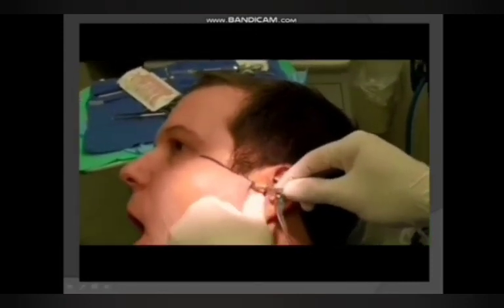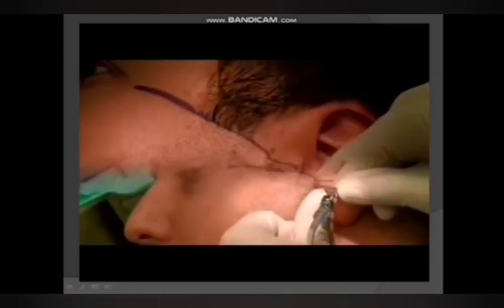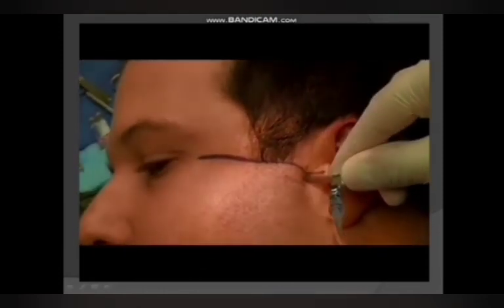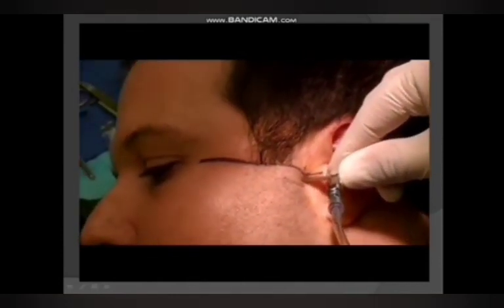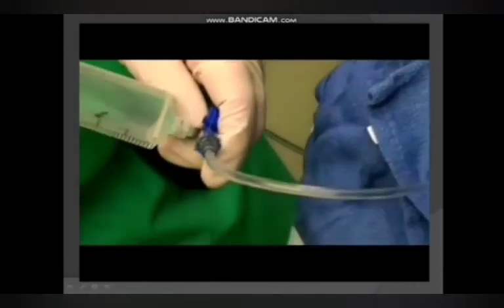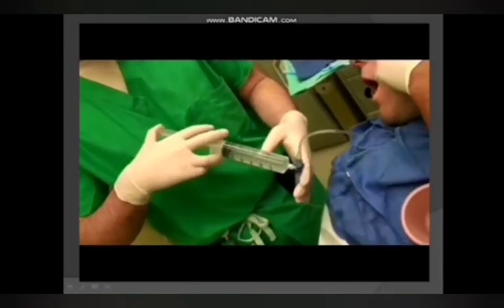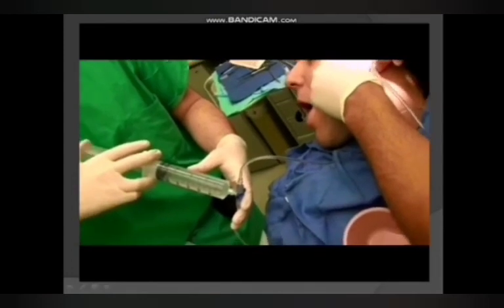The patient's jaw should be in an open and protruded position to make room in the superior joint space for the instrument. Once the instrument is in the joint space, the stopcock is turned on towards the patient and the plunger is pushed with moderate pressure.